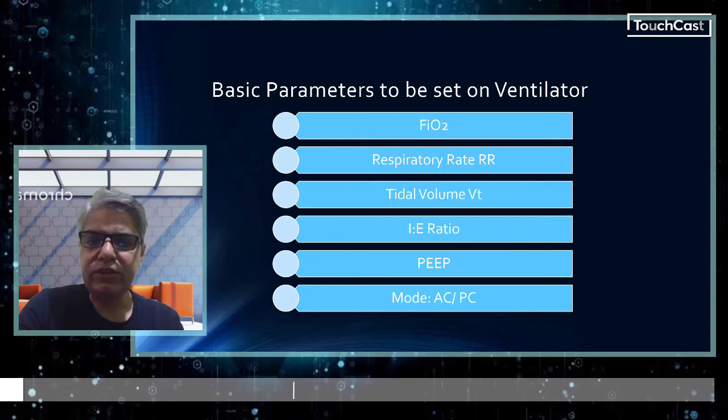So if the child is not breathing, then the machine takes over and delivers some breath, and if the child is actually taking a spontaneous breath, it would give it a little bit of push to help in the breathing. And then SIMV can have some form of pressure support, it can have some form of volume support, and then we have some other forms of modes as well.